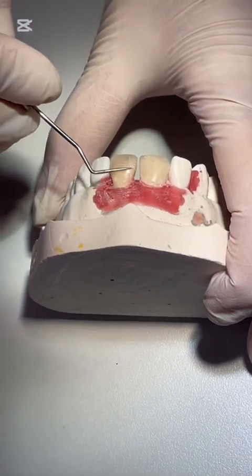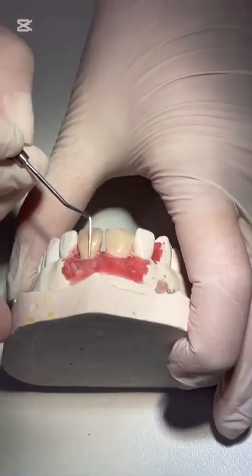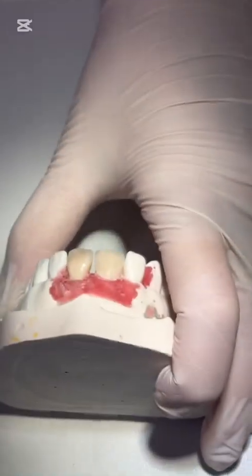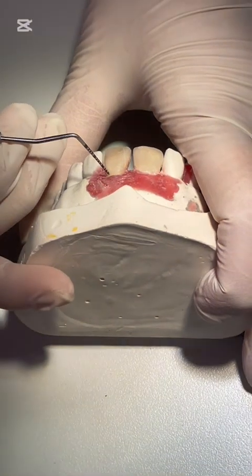So my choices could be between veneers and composite restorations, and I will check that by understanding the proportions. Let's take a periodontal probe. I will measure this. By the way, here is the cemento-enamel junction.